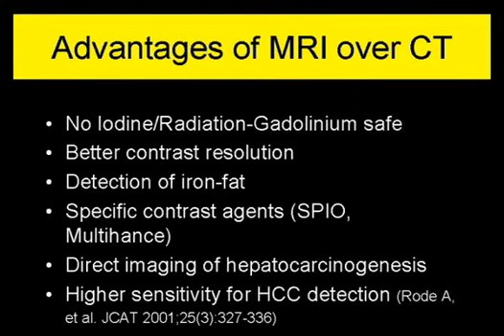You can use specific contrast agents with MRI on top of the regular gadolinium DTPA agents. You can use iron oxides to better characterize chronic liver disease to detect HCC. Some centers have experience in that. We don't use that, but you can use it. One of the latest contrast agents that came to the market recently is called MultiHance and has some biliary elimination and can also be used to better characterize some focal liver lesions.